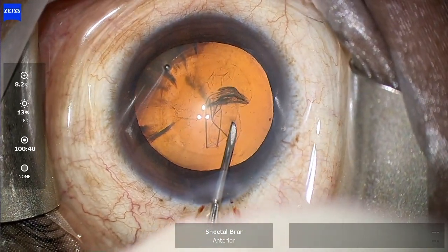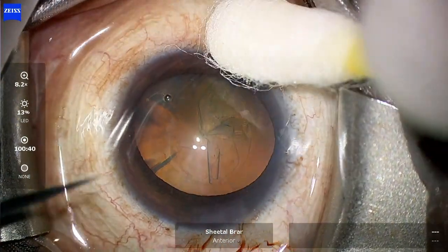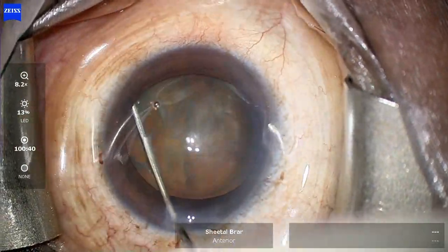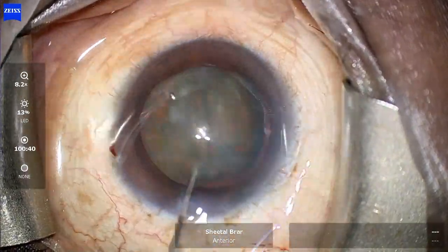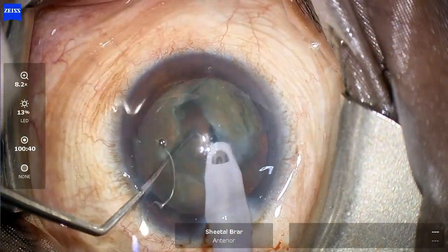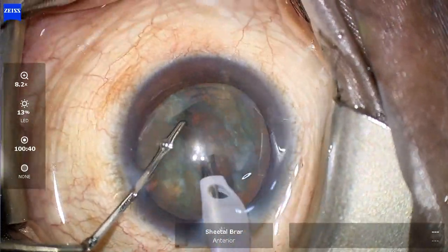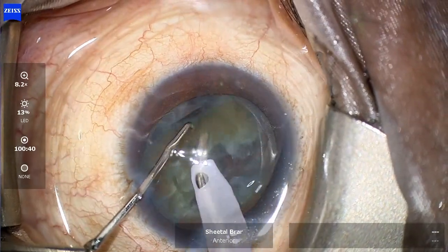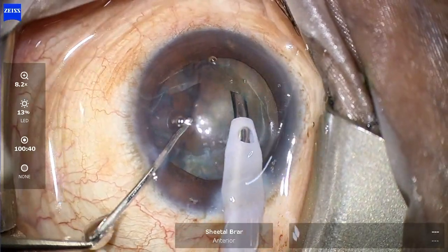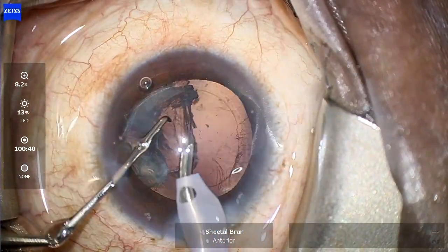Hi friends, I'm back with another interesting case. This is a grade 1 to 2 nucleus sclerosis cataract being operated on a 54-year-old female patient. The rhexis, hydrodissection, and nuclear fragmentation using a stop-and-chop technique — my preferred technique for soft cataracts — seems to be going well. The pieces have been divided and emulsified without any problem, and everything seems fine at this stage, until I withdraw my phaco probe.